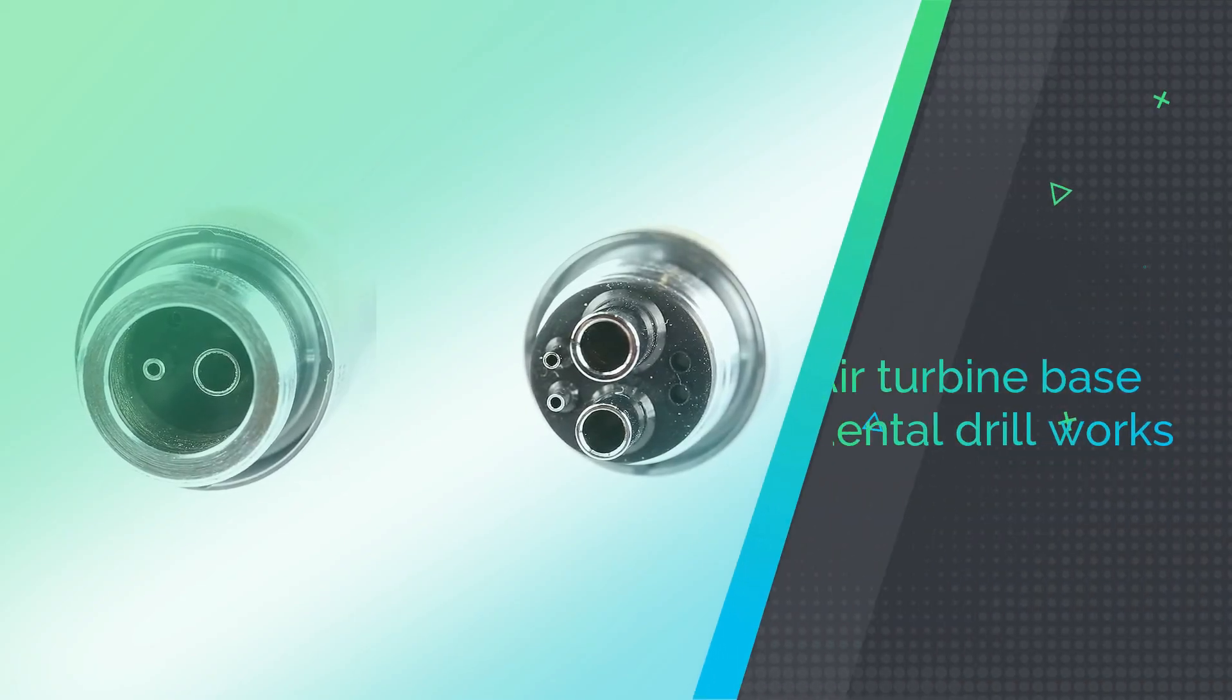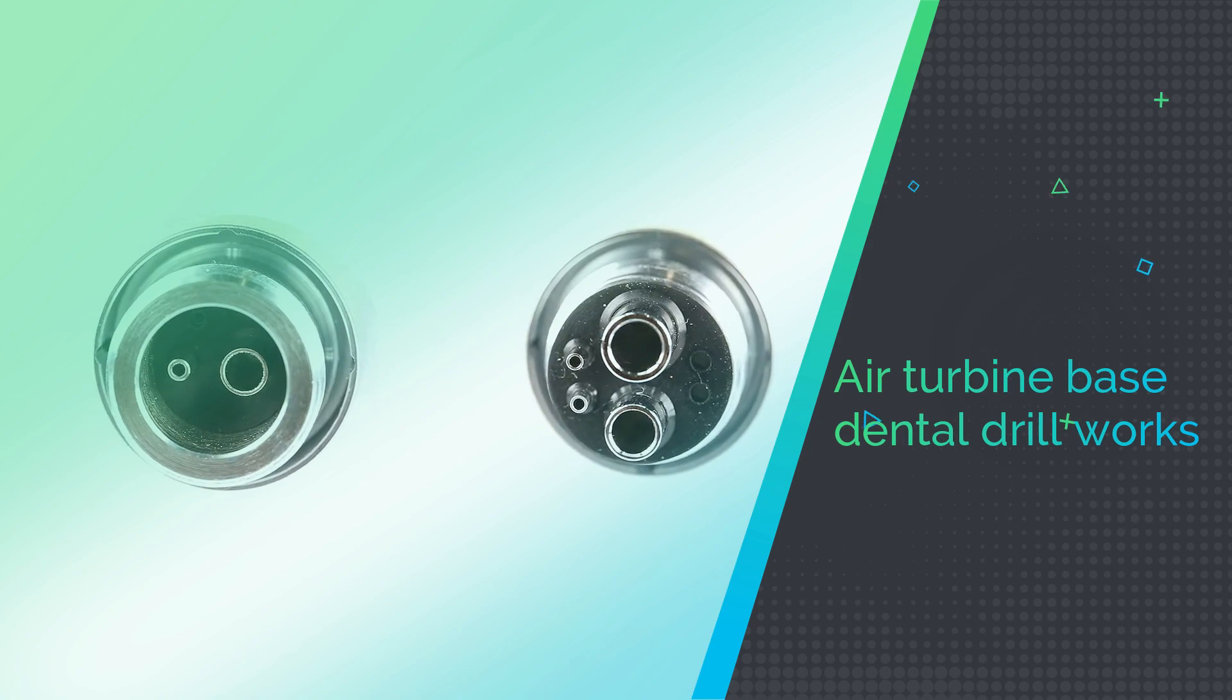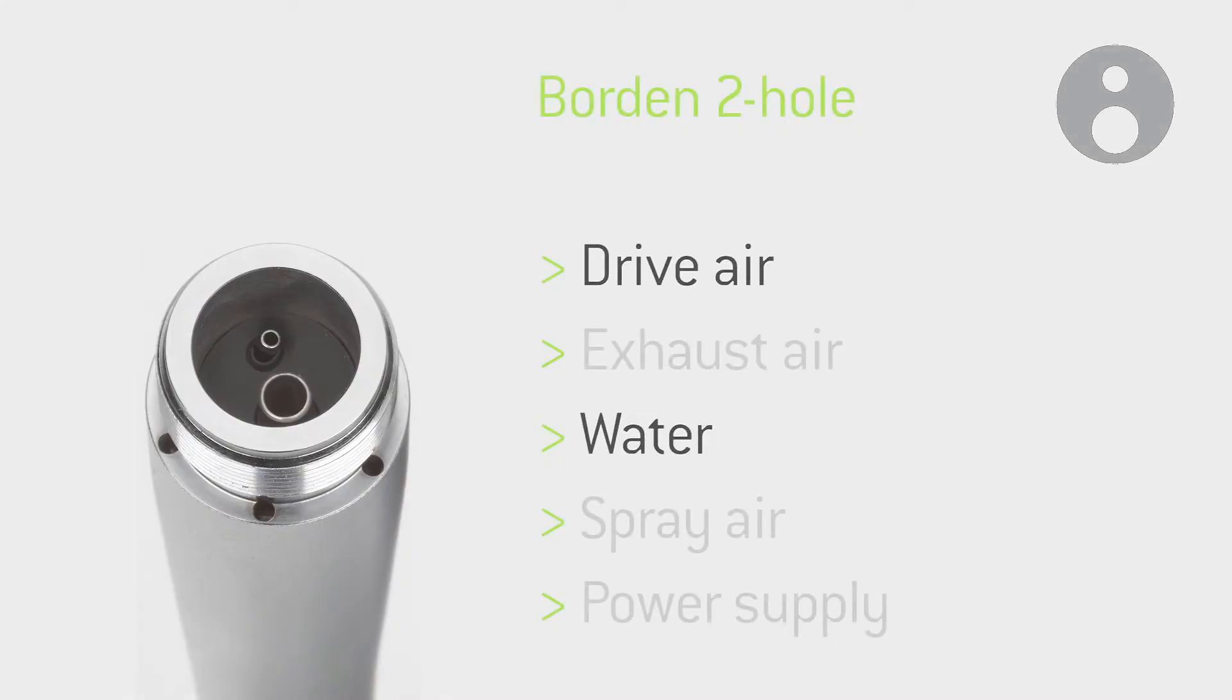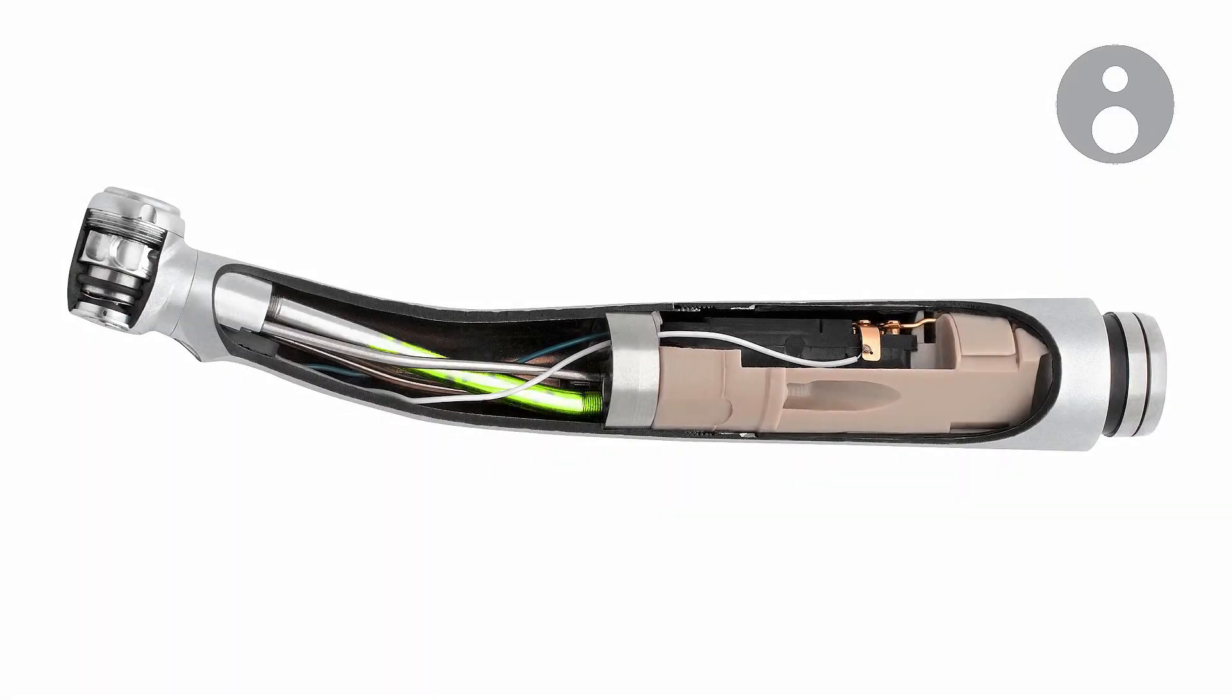So how does an air turbine-based dental drill work? Dental handpieces consist of a handle, or housing, with a small head that accommodates a dental burr, used to perform various treatment and maintenance procedures on a patient's teeth. Inside the handle are the many components that make the burr spin, and the components are powered by either compressed air or electricity.